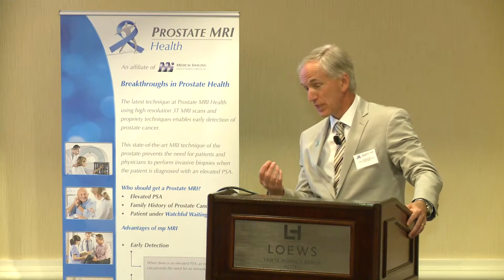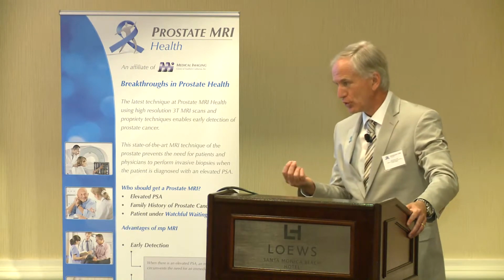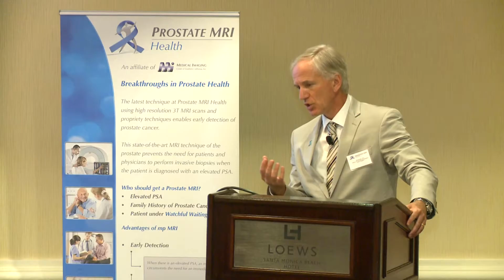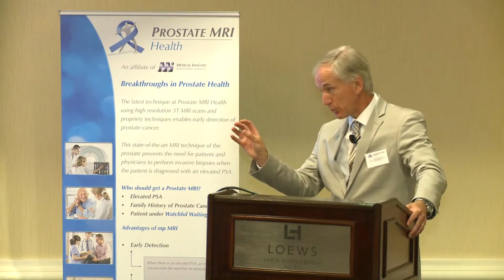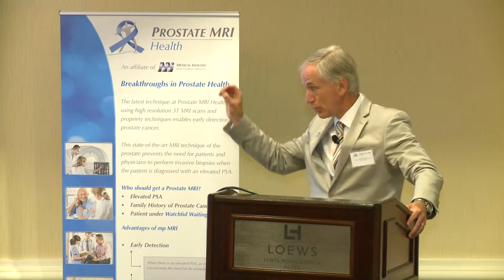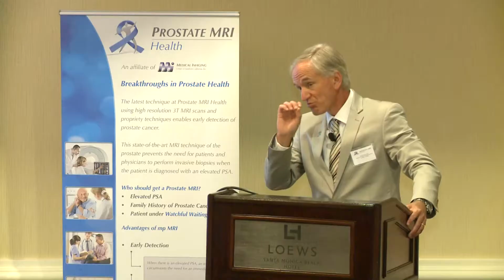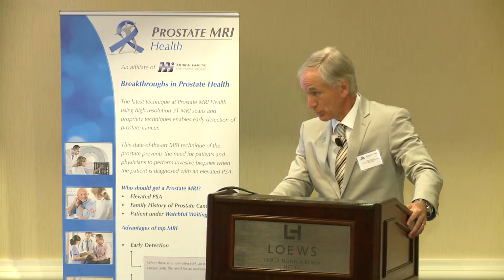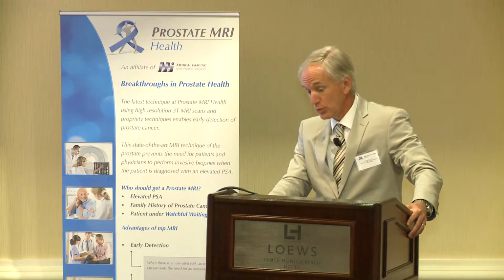I think small tumors, which have a size of 5 millimeters or even 6 millimeters and less, I would prefer to do under MR guidance, direct in the MR bore. If the tumor is large, and I'm talking about the most aggressive part, so the diffusion abnormality, I think we should biopsy not the T2-weighted image, but the diffusion abnormality. If the tumor is larger, I think you can do it safely with TRUS MR fusion. Still, we have to learn a lot. I think we should do prospective studies comparing both techniques.